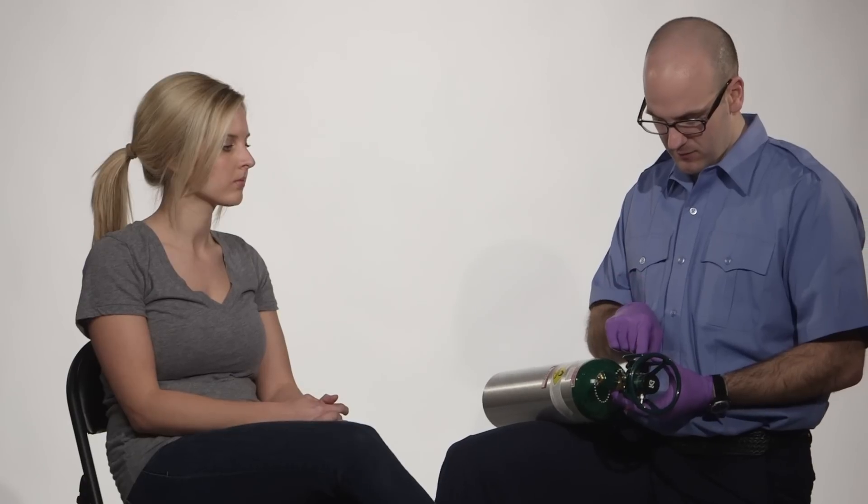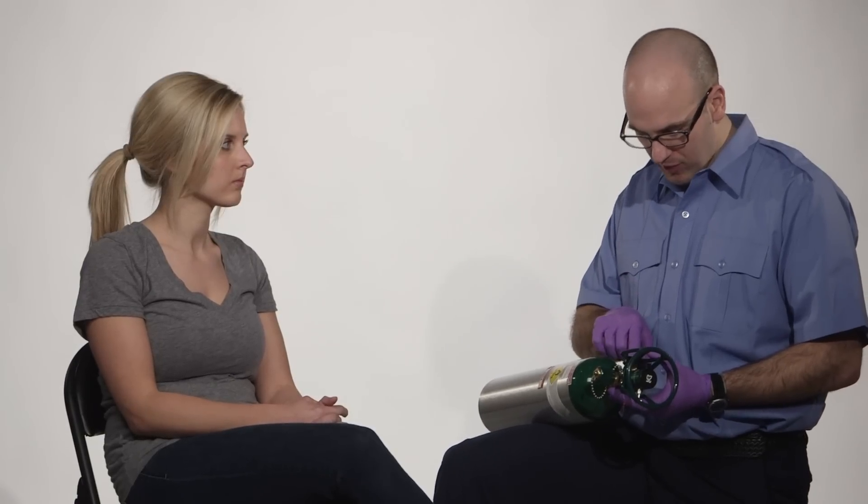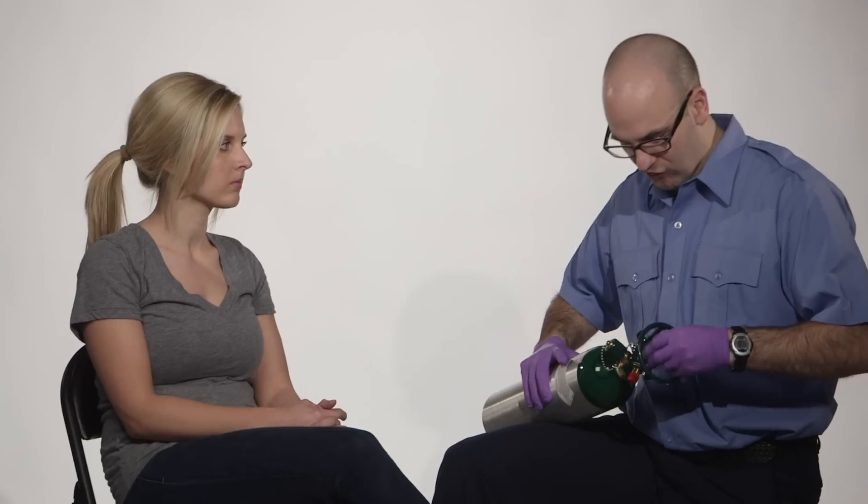I'm going to check my cylinder pressure. My pressure is good. I'm going to check and make sure it works. Cylinder works.